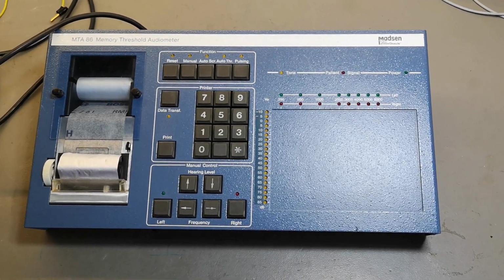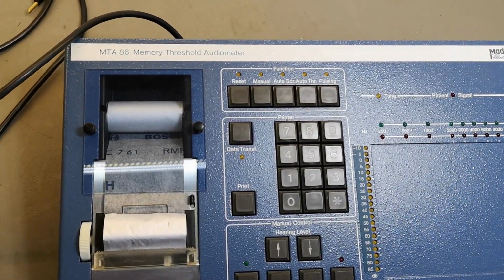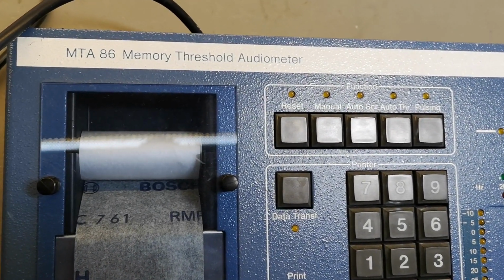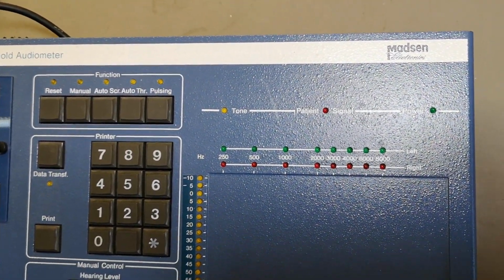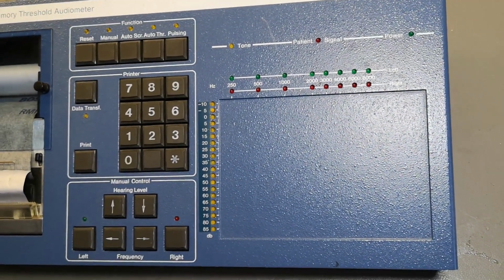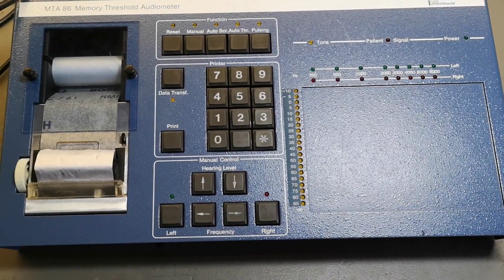Welcome to a new test and teardown video. This time it's an MTA 86 Memory Threshold Audiometer by a Danish company called Madsen Electronics. I don't know yet how old this is, but I have already figured out exactly what it is.